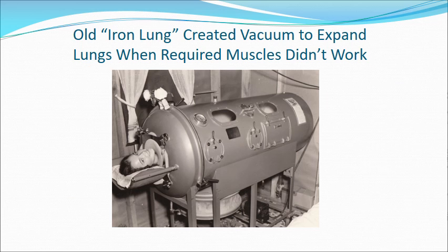Just for a historical perspective, we've shown the original negative pressure ventilator, the iron lung, which enclosed the patient completely, sealed their body, and the vacuum was created inside this container to expand the lungs and then contract it. Modern ventilators are far more compact.